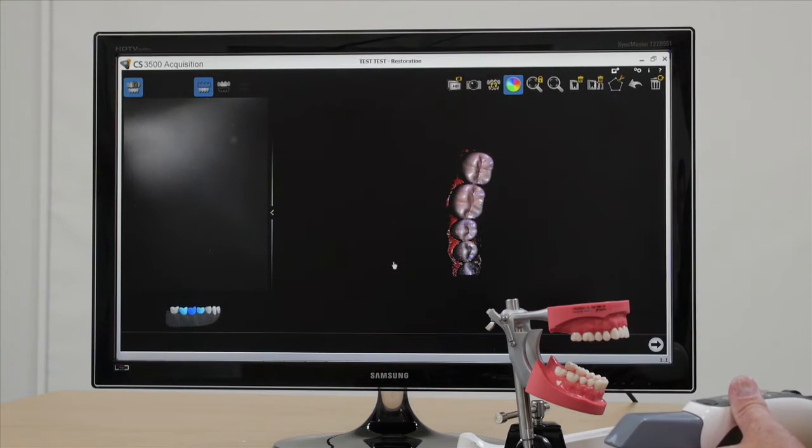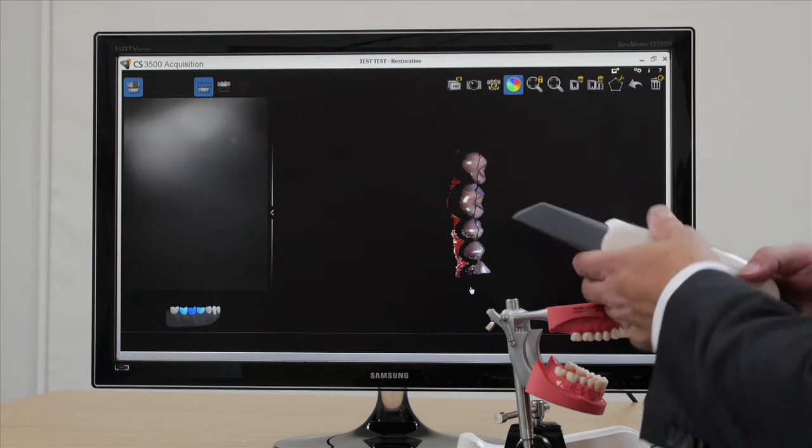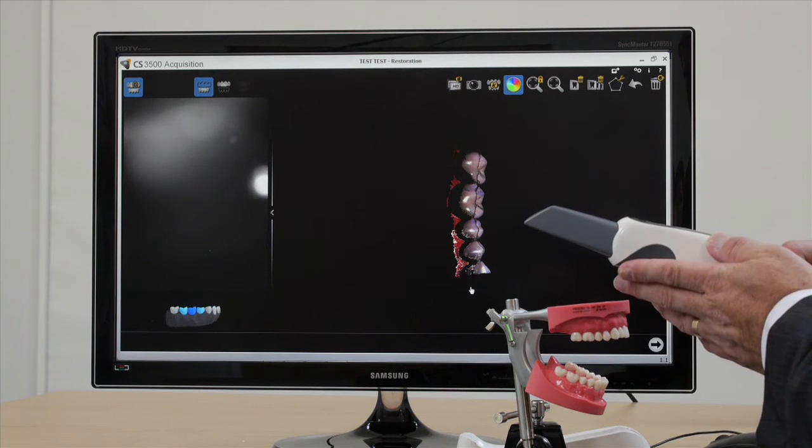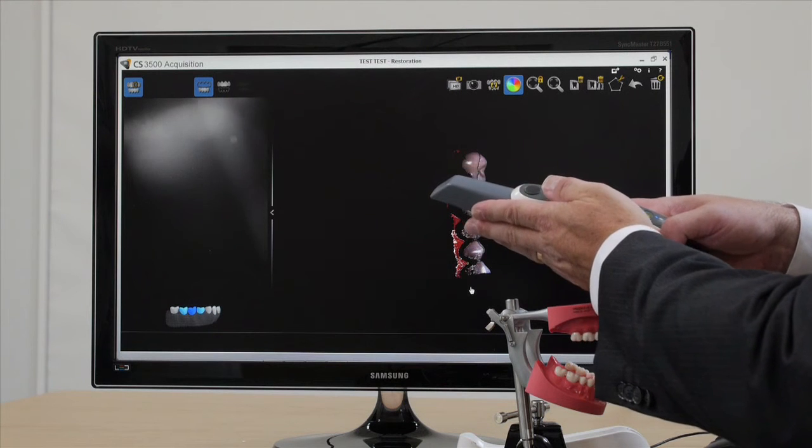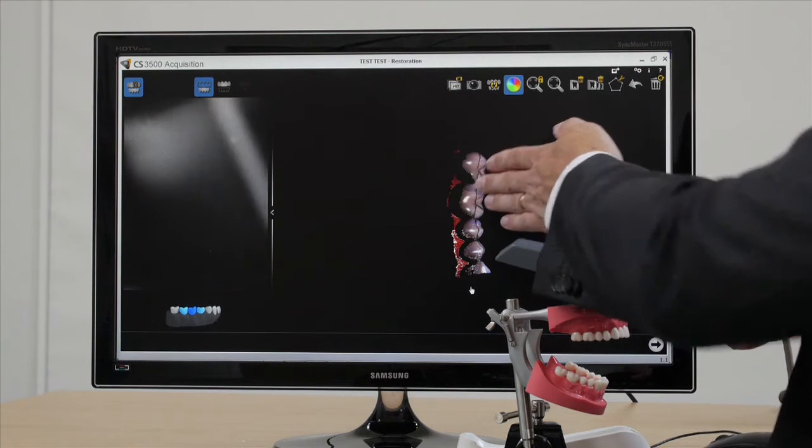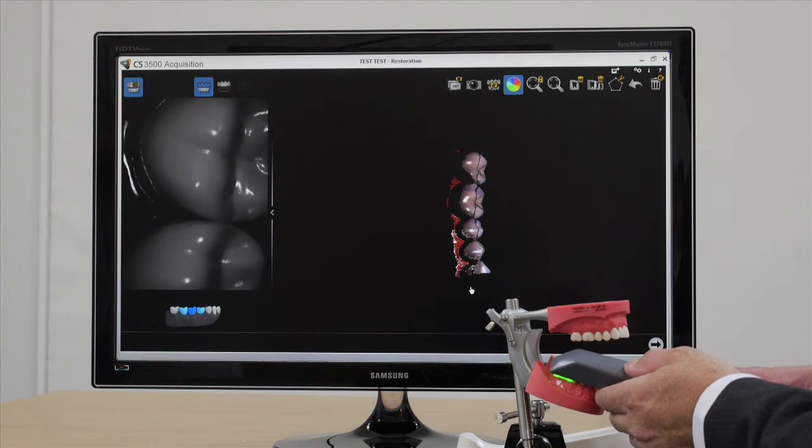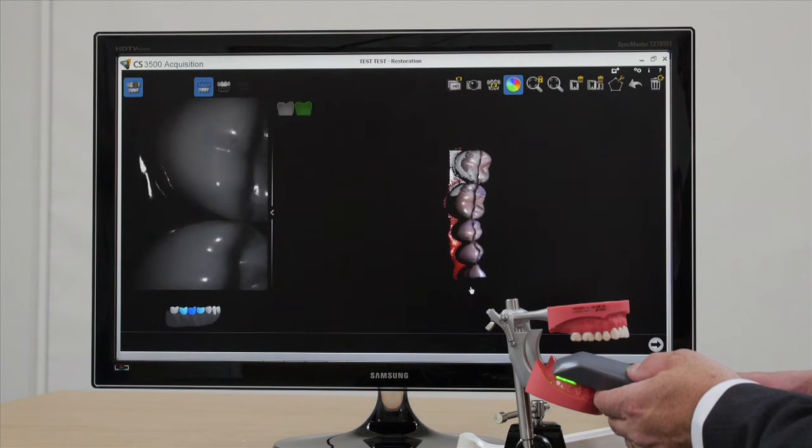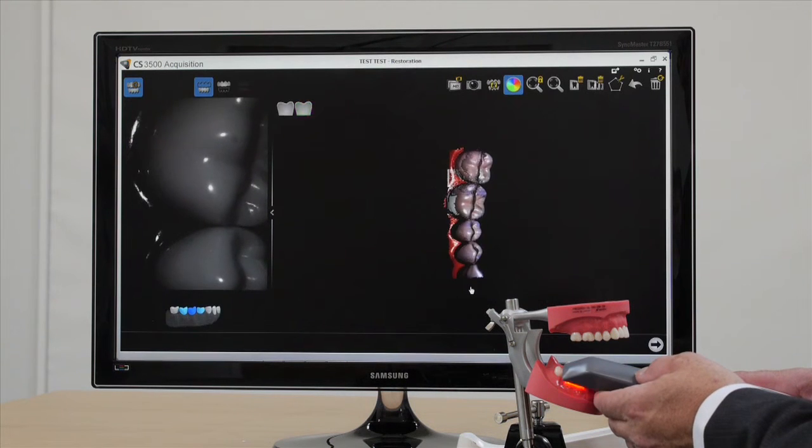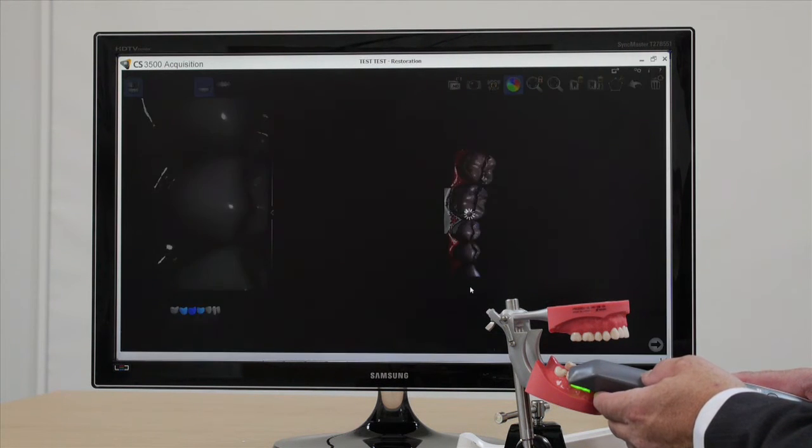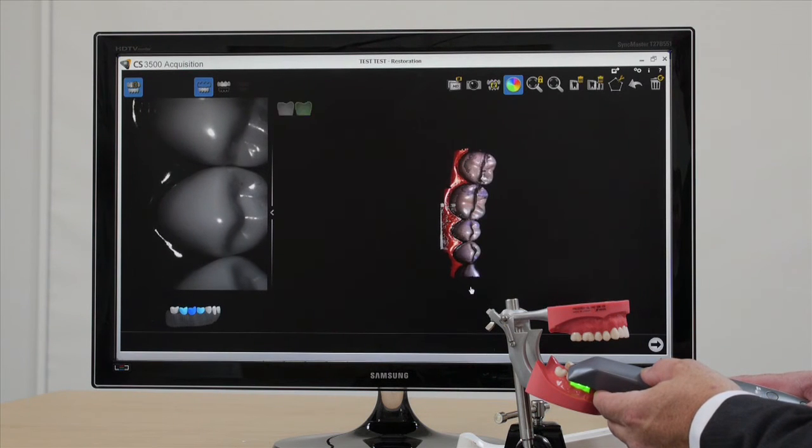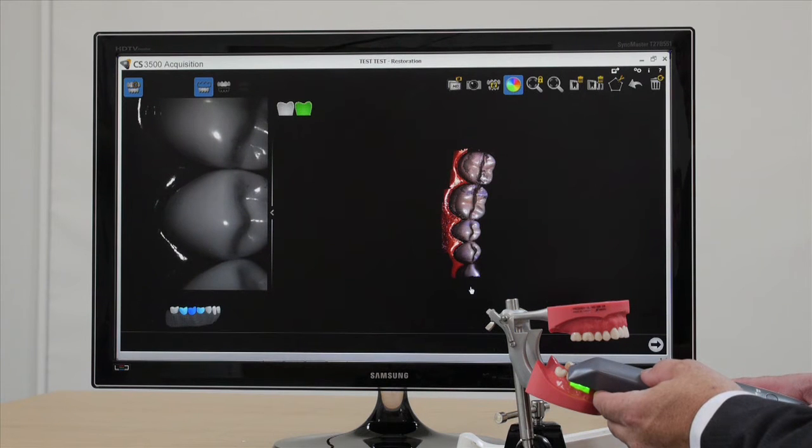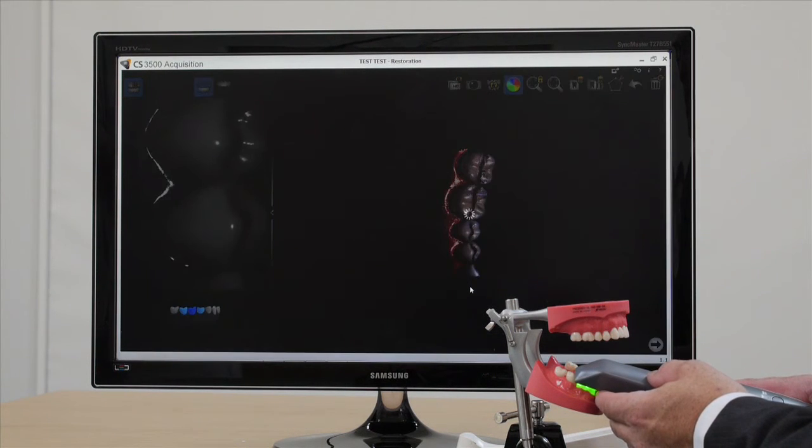I'm now going to turn that image slightly to have a look down the buccal aspect and I'm going to go in. Now, buccal scanning and lingual scanning, just move the tip about 45 degrees so that you're aiming in at this surface. As you can see here, there's the occlusal surface. I'll twist. I'm looking in the left hand screen and you can see in the right hand screen where it's adding material. Now, there's a green little tooth button flashing up there. What that tells me is that all these pictures have been successfully stitched.